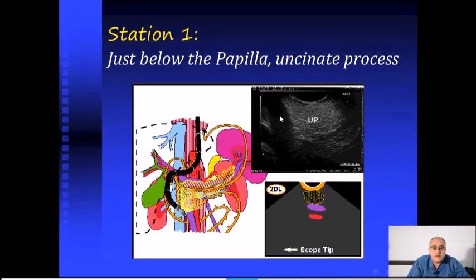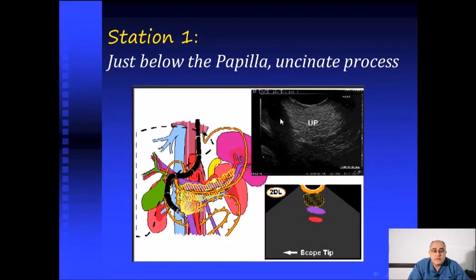We are starting the examination of station one, just below the papilla. The echo endoscope is just below the papilla, and here we perform upward deflection using the big wheel.